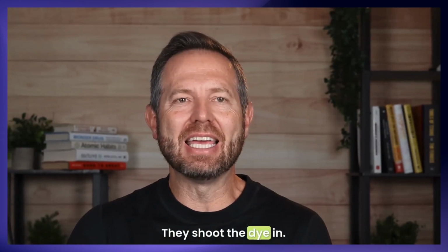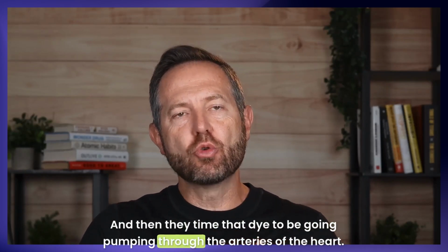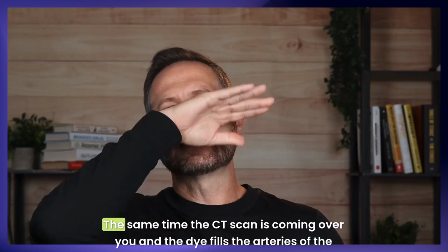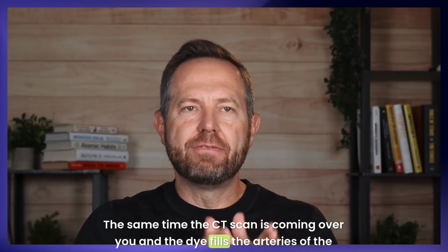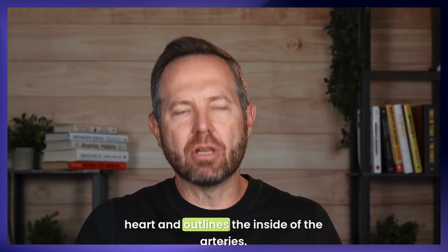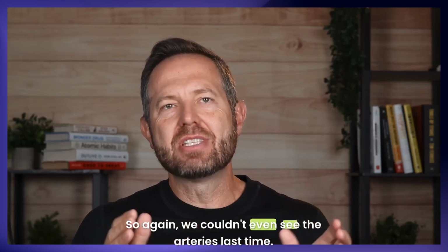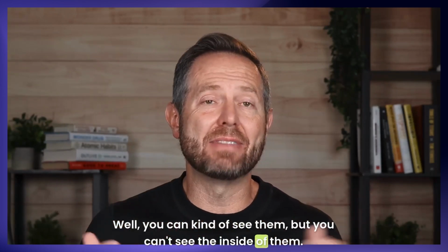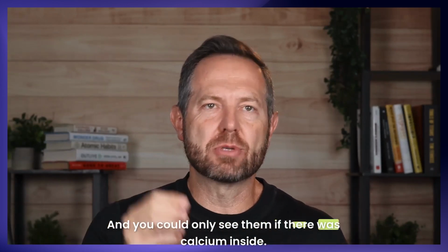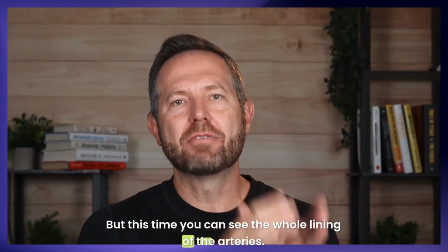They shoot the dye in, and then they time that dye to be pumping through the arteries of the heart at the same time the CT scan is coming over you. And the dye fills the arteries of the heart and outlines the inside of the arteries. So again, we couldn't even see the arteries last time. Well, you can kind of see them, but you can't see the inside of them. And you could only see them if there was calcium inside. But this time you can see the whole lining of the arteries.